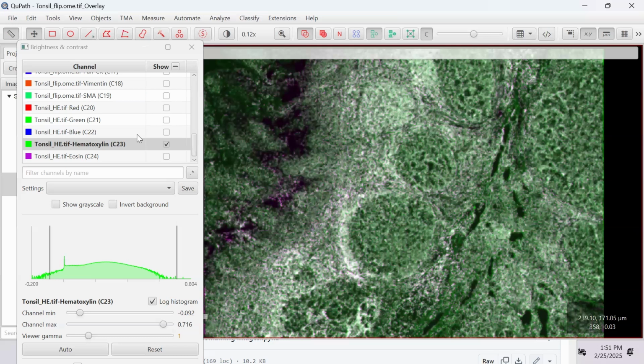For example, you may be working on a tumor sample and you're very interested in collagen, and the fact that collagen might provide a barrier for your T cells to go into that tumor and kill it. You have a staining for your T cells, but you don't have staining for collagen within the immunofluorescence image. You can stain for collagen afterwards using classical histological stains. And now you can combine that information, and you can, for example, get a distance from your tumor-infiltrating immune cells to collagen fibers.